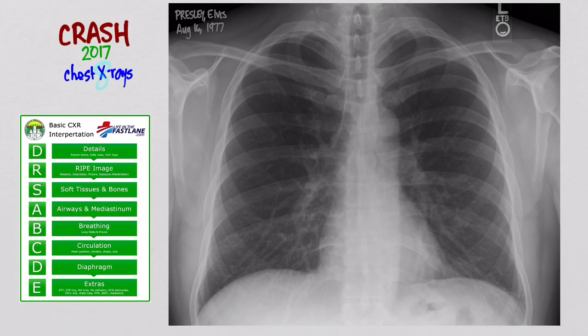Next is R for ripe. When you get a fruit like a mango that's ripe, it's really good. So you want to make sure your X-ray is also really good quality. There are a couple of things you look at: rotation, inspiration, picture, and exposure. For rotation — is the patient twisted or facing sideways? The way you assess that is you look at the clavicular heads. These clavicular heads should be about equidistant from the spinous processes, which represent the middle of the X-ray. In this case it looks pretty good.